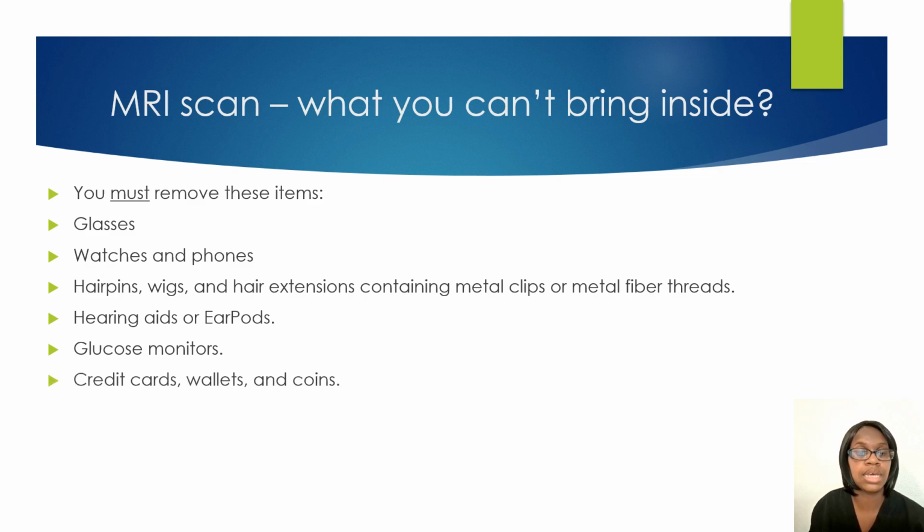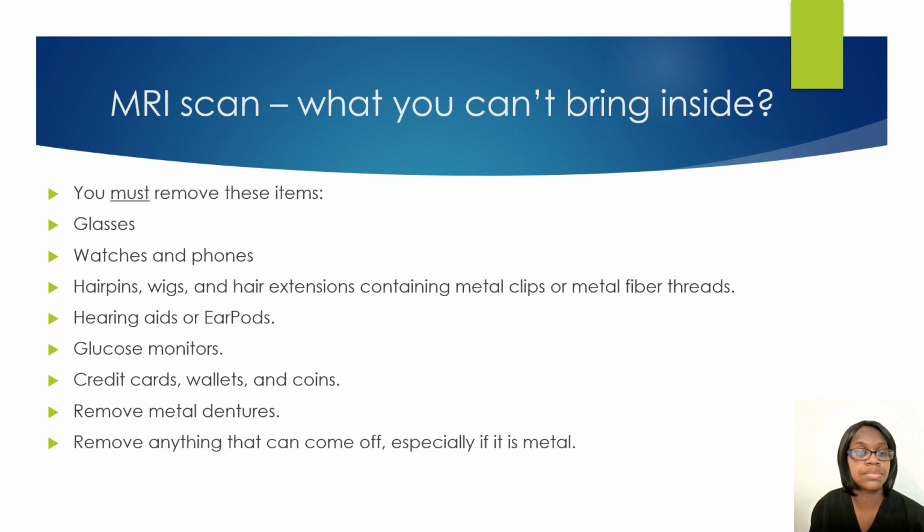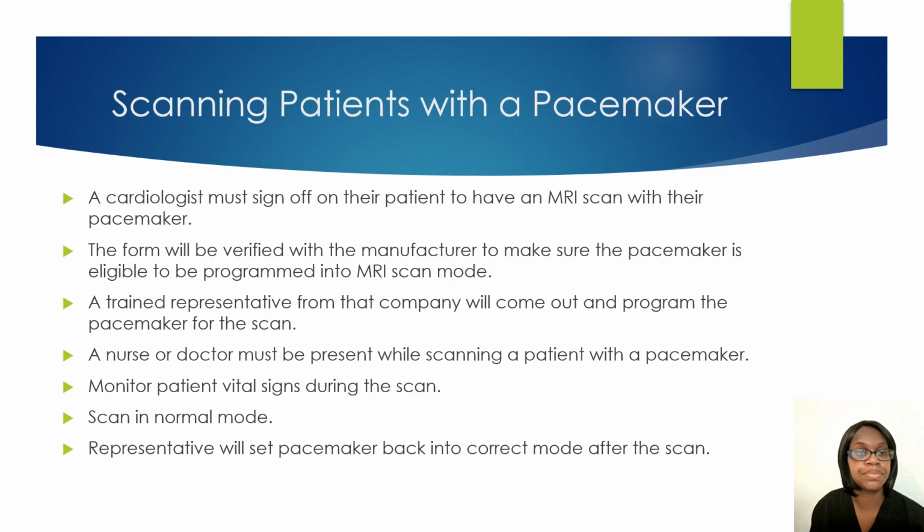Credit cards, wallets, and change, make sure they remove that. Remove metal dentures. Remove anything that can come off, especially if it is metal.